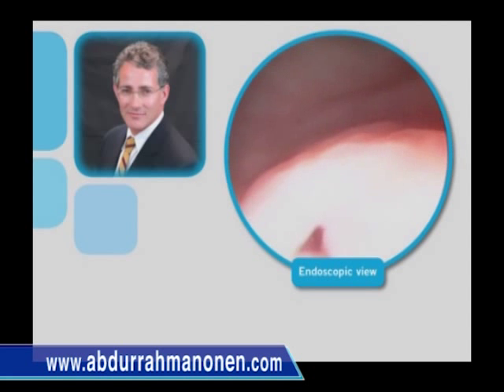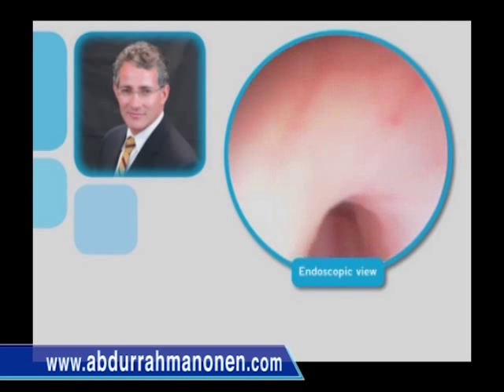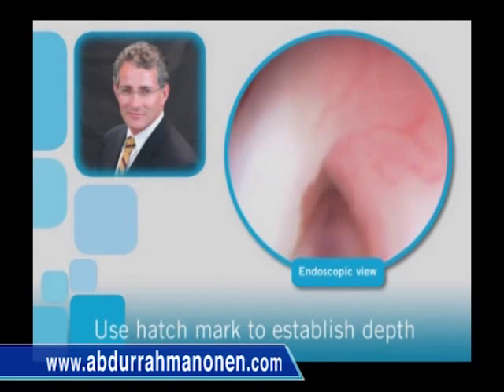When the ureteral orifice is not noted to hydrodistend easily, the needle may be placed in similar to placement of a ureteral catheter, and hydrodistension will then be performed once the tip of the cystoscope is placed in the orifice, as shown here. With this technique, the proper depth of injection may be seen by placing the needle to the point of the hash mark on the needle.